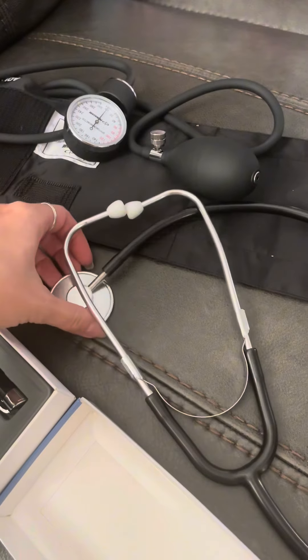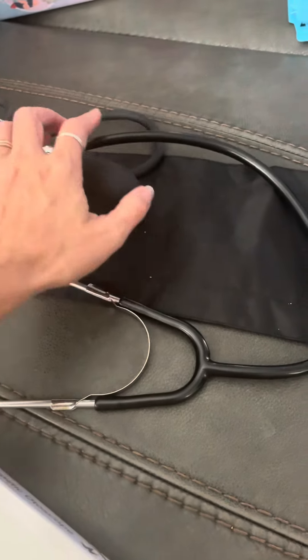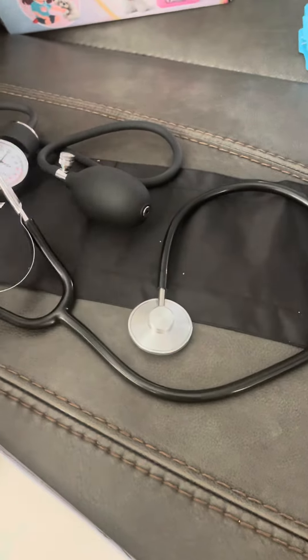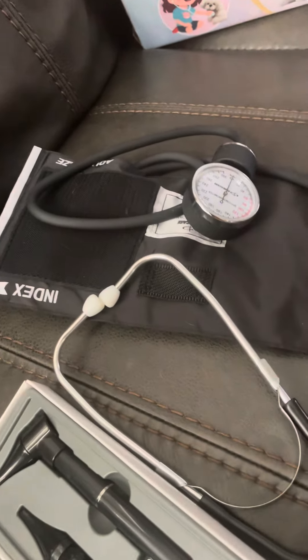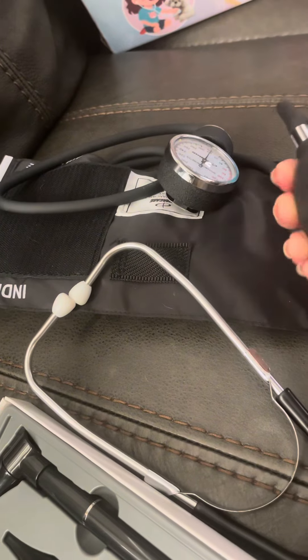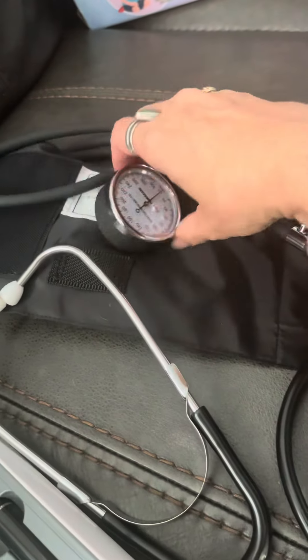But this stethoscope really does work. It's not the best quality, but it really does work. This blood pressure checker is amazing — this works. And you would just press and click this thing, then turn it to release the air.